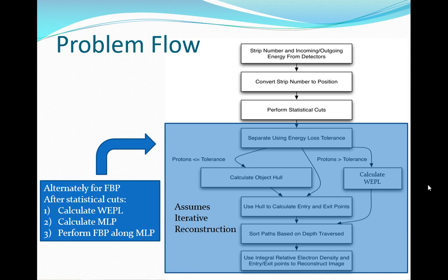So it hit a nucleus in the front detector? Somewhere inside the object or whatever else. But if it's coming in one way and it's not close to aligned, even on you, we give it so much energy, it should pass through you with very little deflection. I see. So you're comparing before the body to after the body? Before and after. We call that the front and the back. Front detectors to the back.